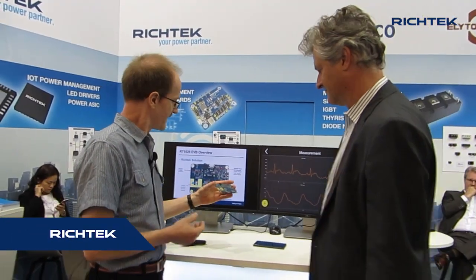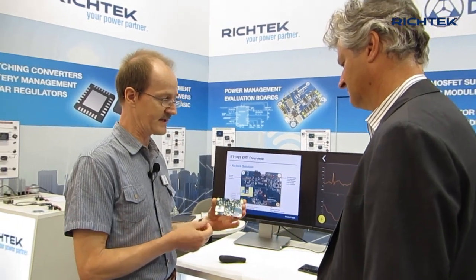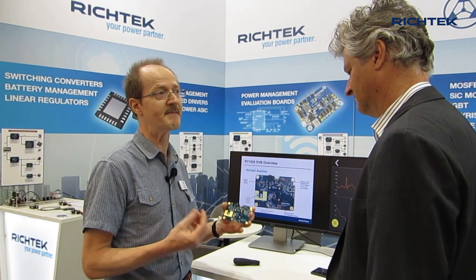This is the Richtek RT1025. It's an integrated sensor that includes two measurement techniques. The first measurement technique is an electrocardiogram, basically measuring the electrical pulse from your heartbeat in an electrical way.